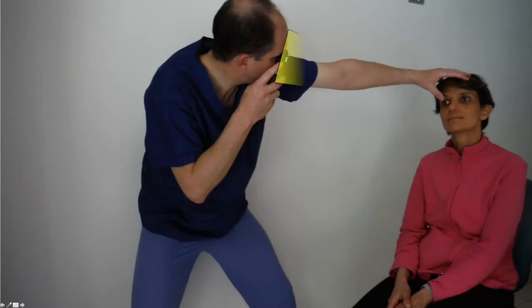You should already have a red reflex, and this beam of light is your flight path, down which you must move your head by using most of the muscles of your body to move towards the patient. Here is that flight path from a different angle, and you can realize how easy it is to veer off that flight path and lose all sight of the retina.